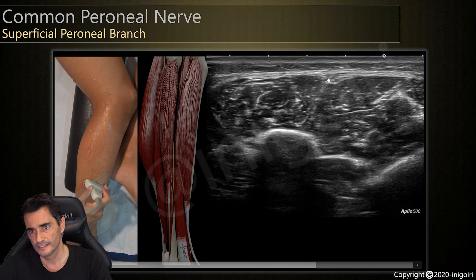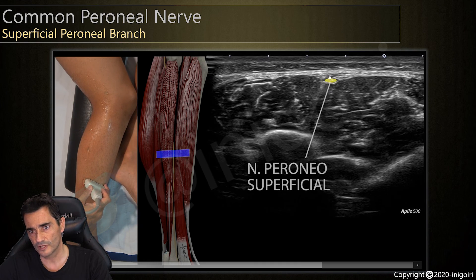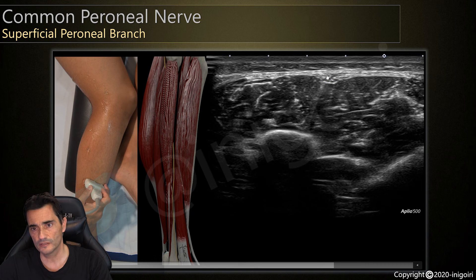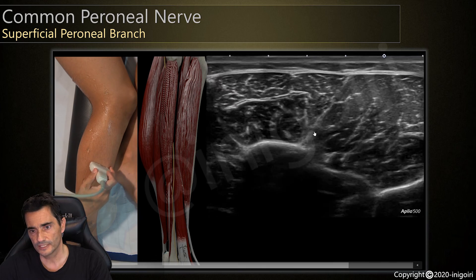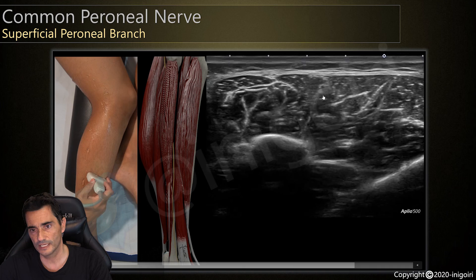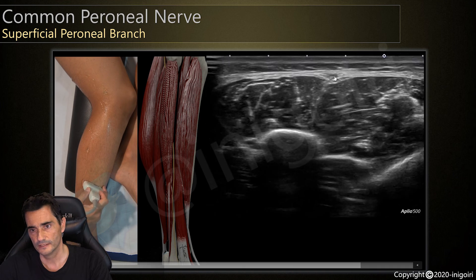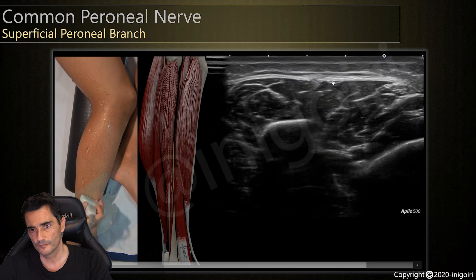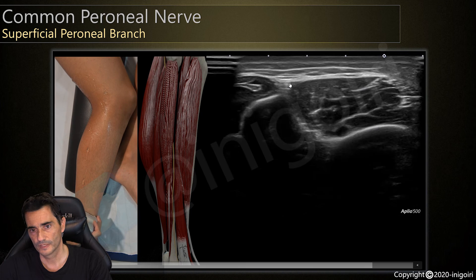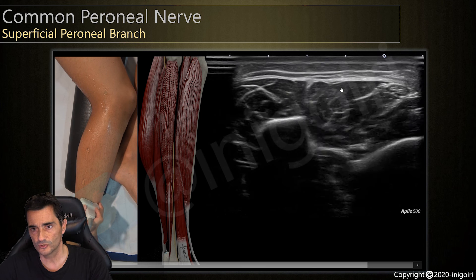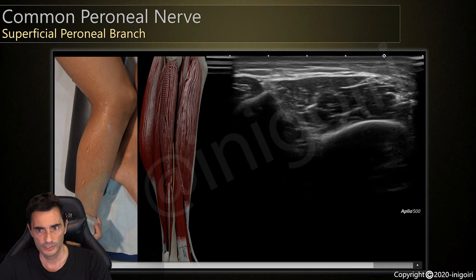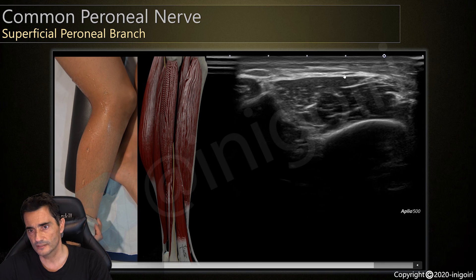Here it is — this is the superficial peroneal branch, the superficial peroneal nerve or superficial fibular nerve. Moving the probe proximally and distally confirms its position. The nerve will be superficial to the extensor digitorum muscle — this is the extensor digitorum muscle and this is the nerve running superficially at this level.